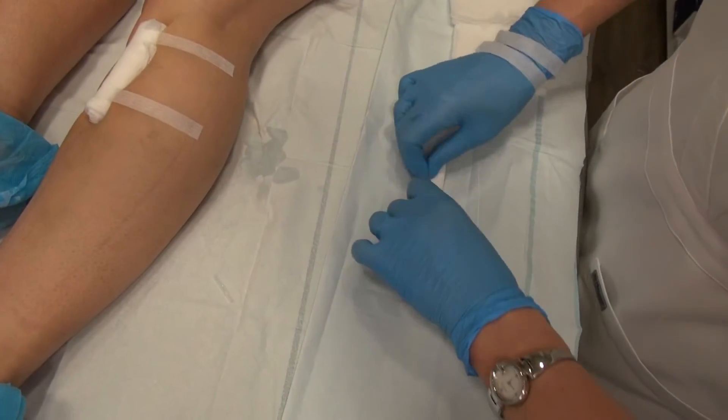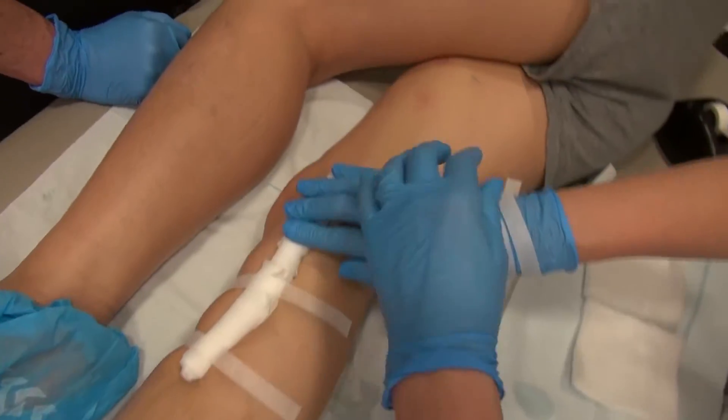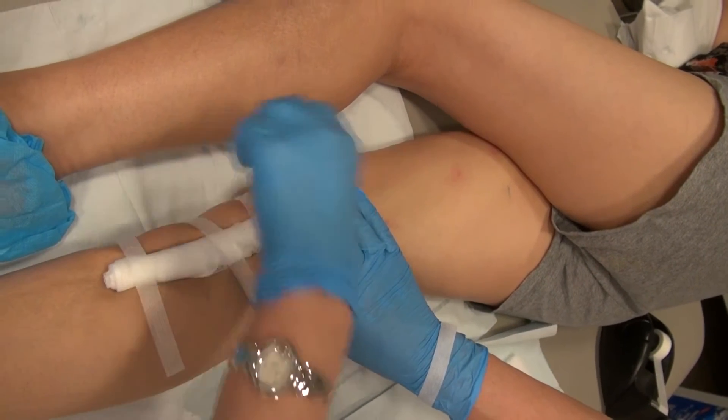When we are finished injecting, we tape some padding over the treated vein and then a medical compression stocking is applied.